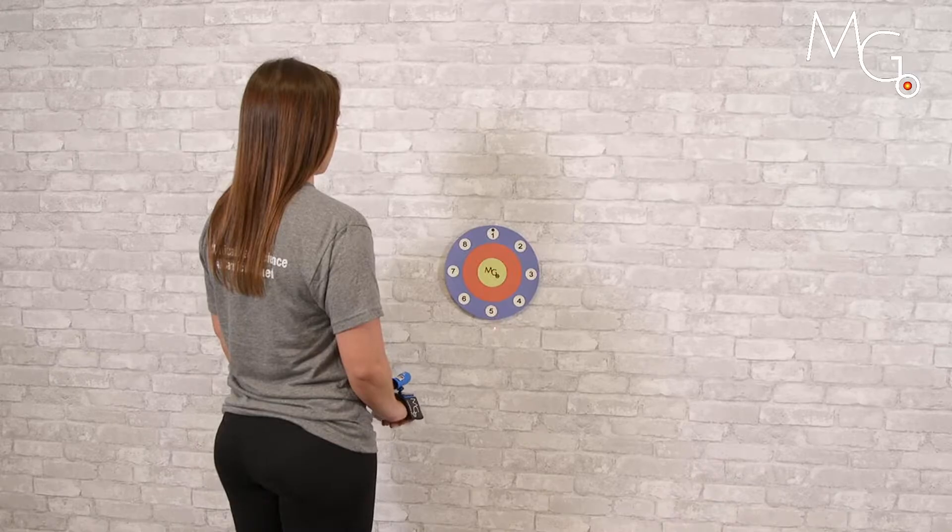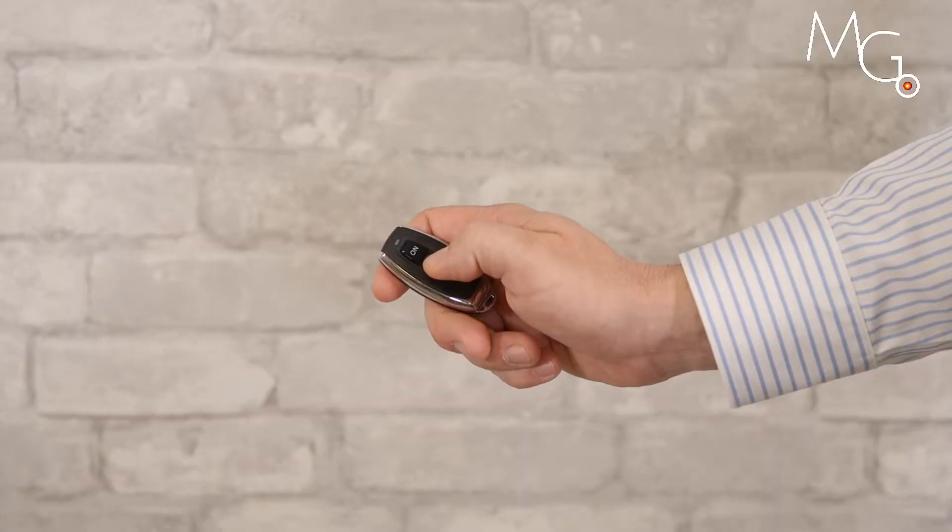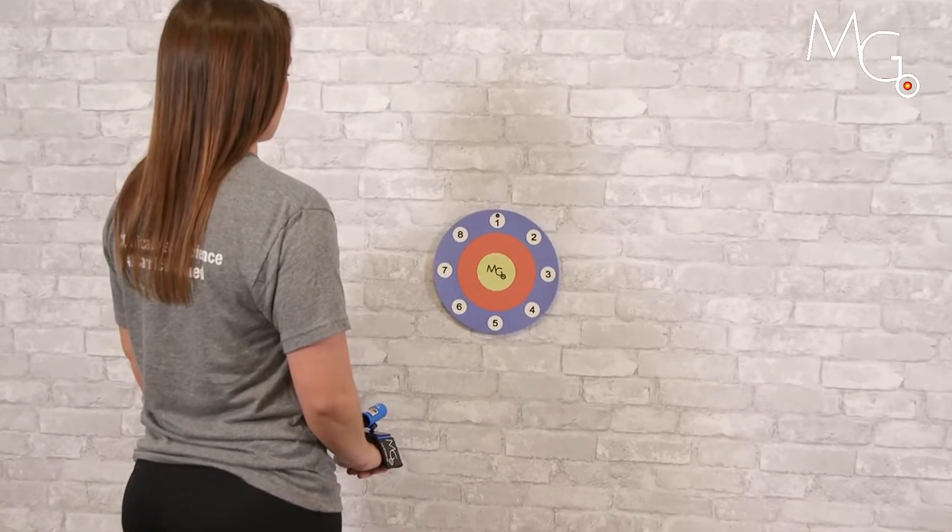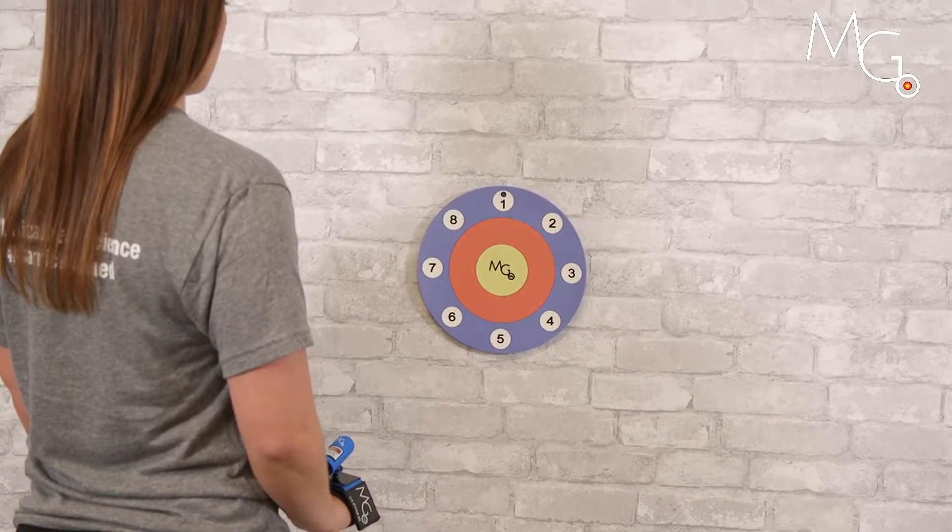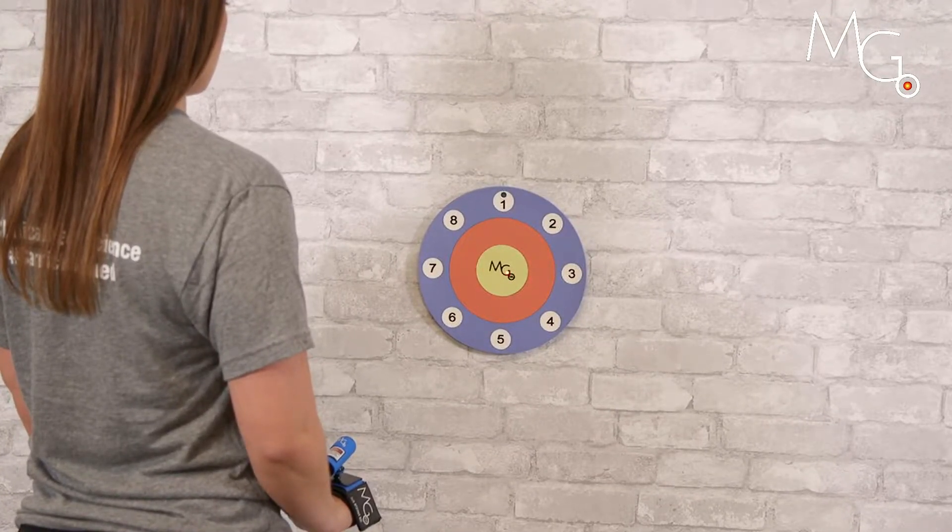And then come back down. I'm going to turn the laser off with a remote switch. And now go back to where you think the laser is in the middle of the target, extending your wrist. And I can turn it back on. Well done.